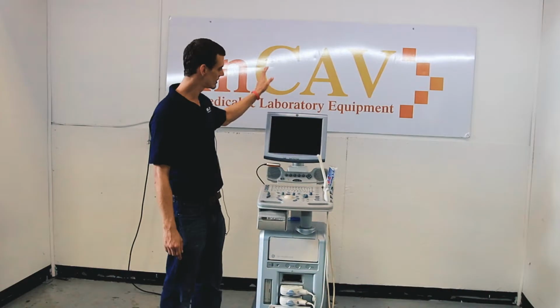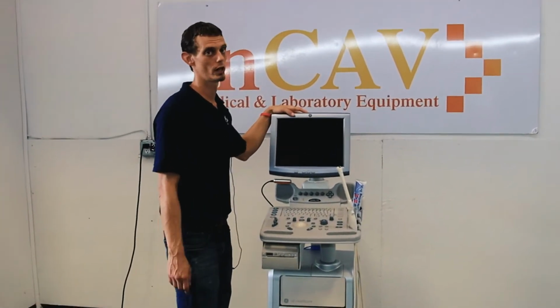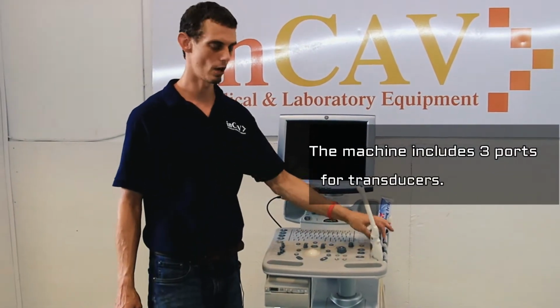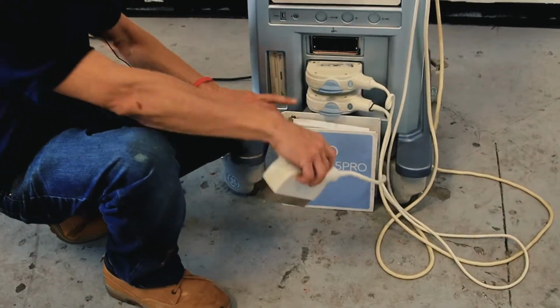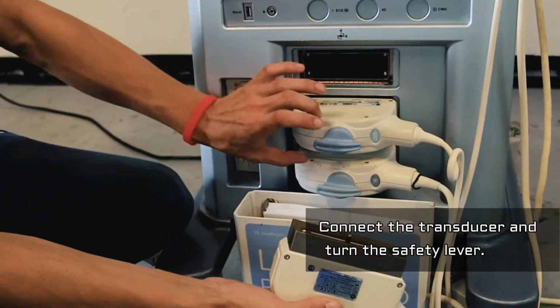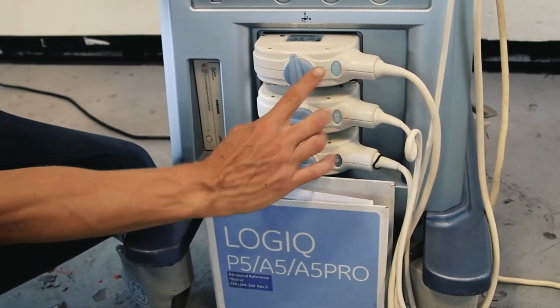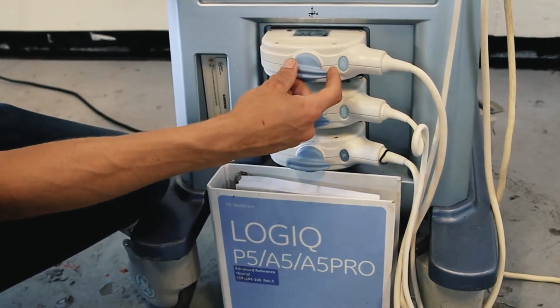Okay, so it's very easy to use the system. First, of course, you want to make sure that your transducers are all plugged in properly. You can't actually use any of the items without them being plugged in here. It's very simple. We have two already plugged in. It doesn't matter which ports you use. You can change these around and it'll still work all the same for your transducers. You just simply take the set here, plug it in, and then this is your locking mechanism to make sure that it's not going to come out during the procedures.